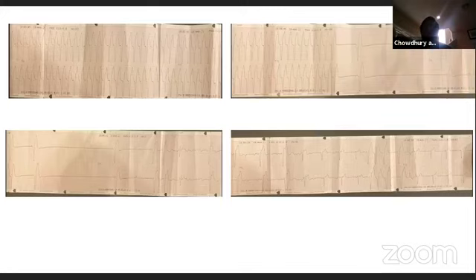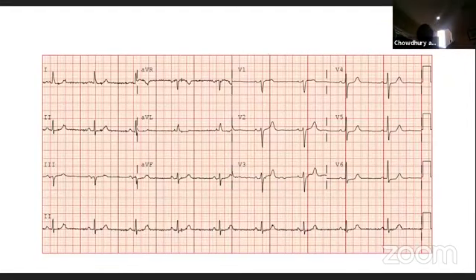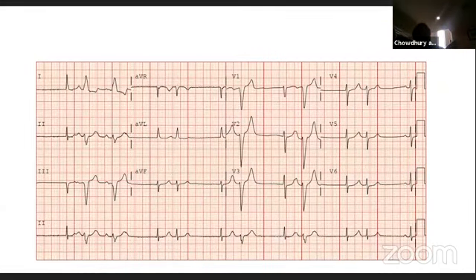And the question for you, Rafiq bhai, is that after the break of the VT, you can see now the narrow complex and then wide complex. And the wide complex, these PVCs, and I'm calling it PVC, are actually similar to when the patient is in VT. Moreover, this is the EKG after the patient is in sinus rhythm. You can see the wide complex, for example, in lead 1 and also in lead 2. This wide complex looks the same as in VT.